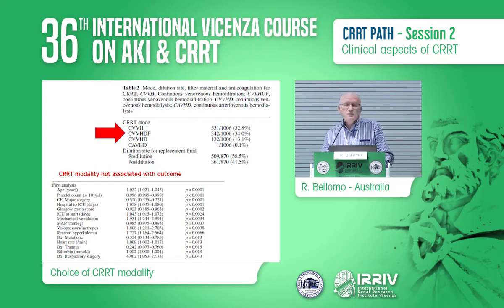This gave us the opportunity to ask the question, does it matter? Is there any association between the modality of CRRT that you've chosen and the patient outcome? And when you look at all the variables that were associated with patient outcome, the modality was not associated with patient outcome, suggesting that it doesn't matter.